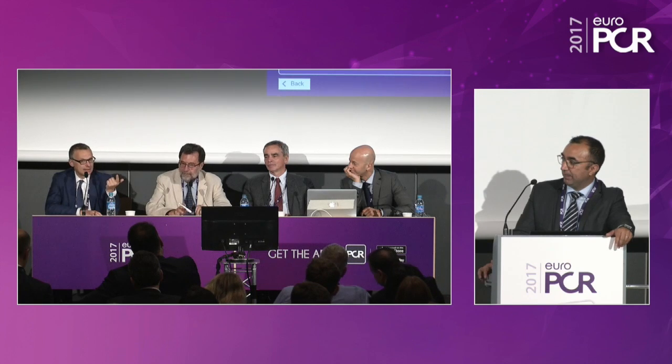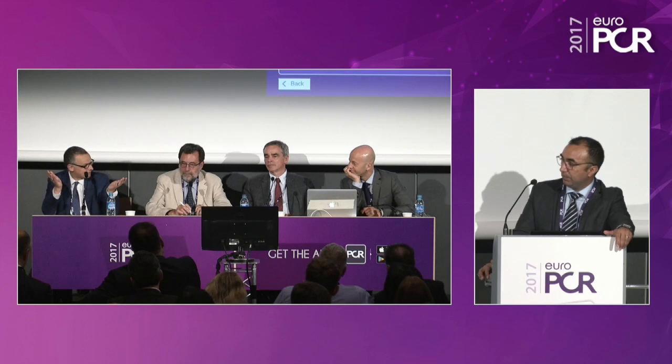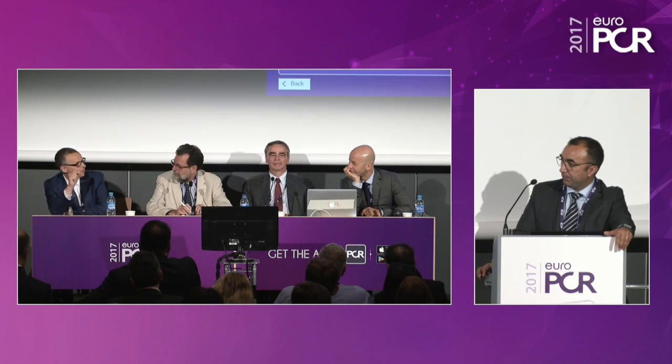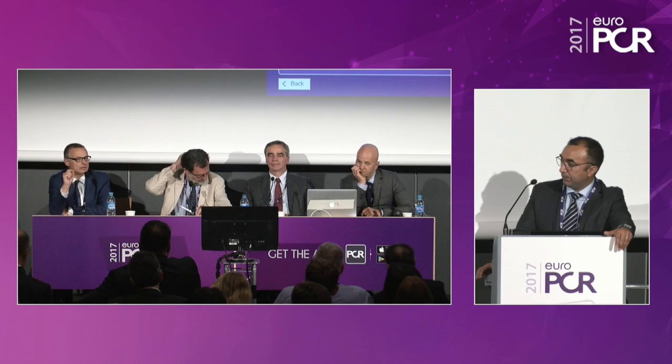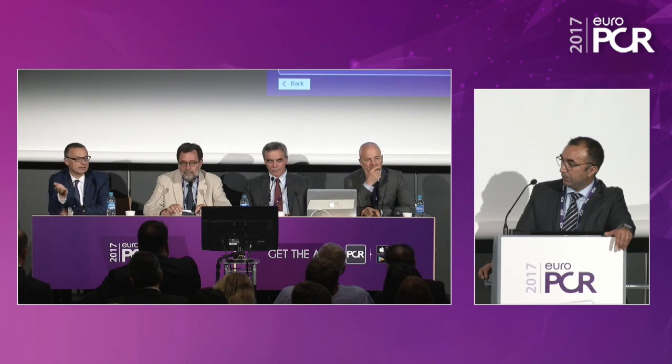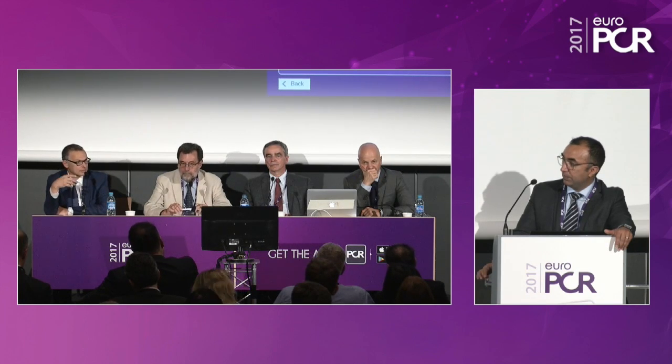Number two, in surgery, I guess what kind of ring I have to implant. Here, I adjust on the beating heart. And you know, there have been some cases where we have been doing the opposite of what Azim has shown. Sometimes it's good to cinch more, sometimes it's good to cinch less, because if you cinch too much, you may have a frozen leaflet. Now, having this possibility of adjusting online makes this, to me, surgery 2.0. I mean, it's better than surgery.